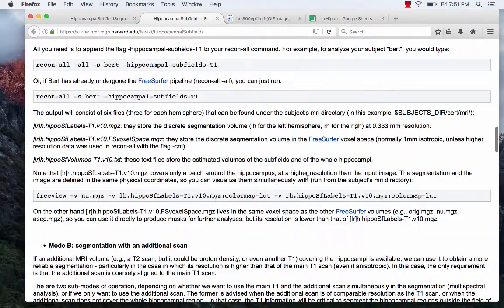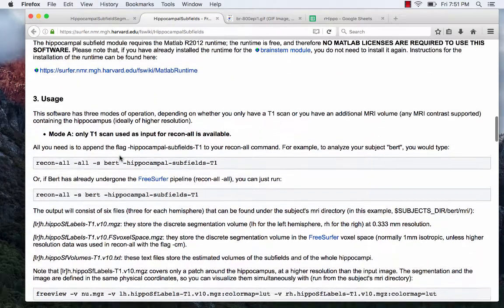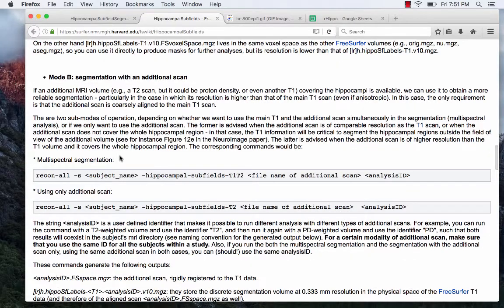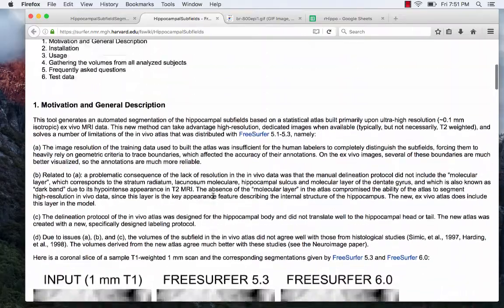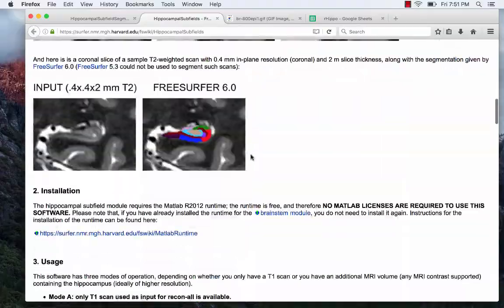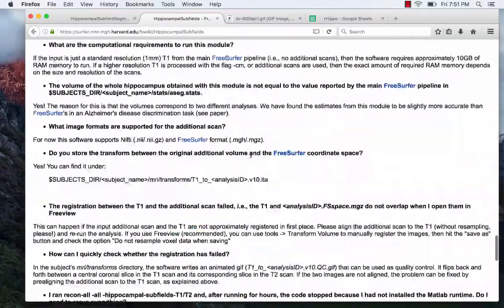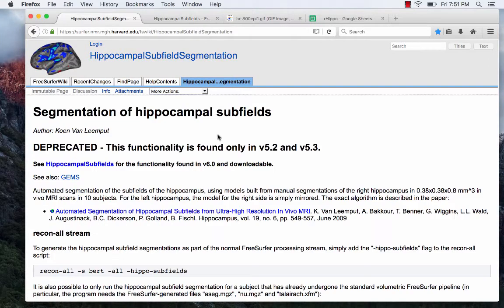Another nice thing about the 6.0 version is that if you want to run it with supplemental images you can. You process it with a T1-weighted image as input, but for 6.0 it says if you want to run it with additional scans for better accuracy you can — for example, you can run it with a T1 and a T2 as inputs, or even an additional T1 specifically focused on the hippocampus. In my lab we didn't have T2 images for most scans, so I'm going to do the 5.3 version.